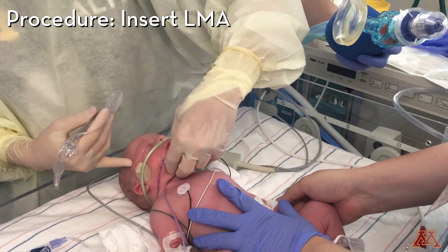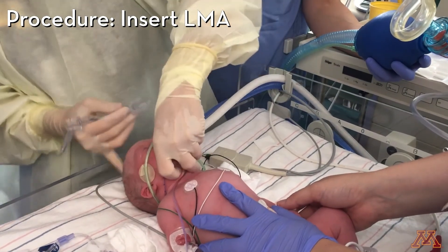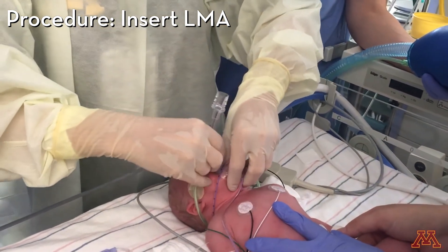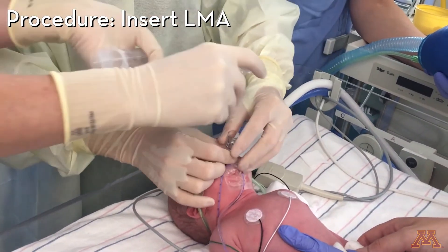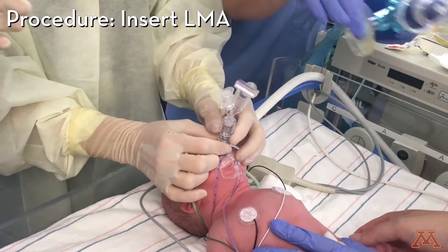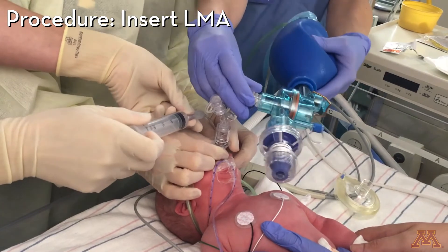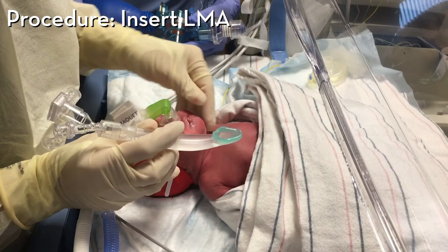The first video demonstrates insertion using a cuffed LMA. Inflate the cuff with 3 cc's of air. Saturations are great. The second video demonstrates insertion using an LMA without a cuff. Notice the Y-piece and CO2 detector are attached to the LMA prior to insertion.